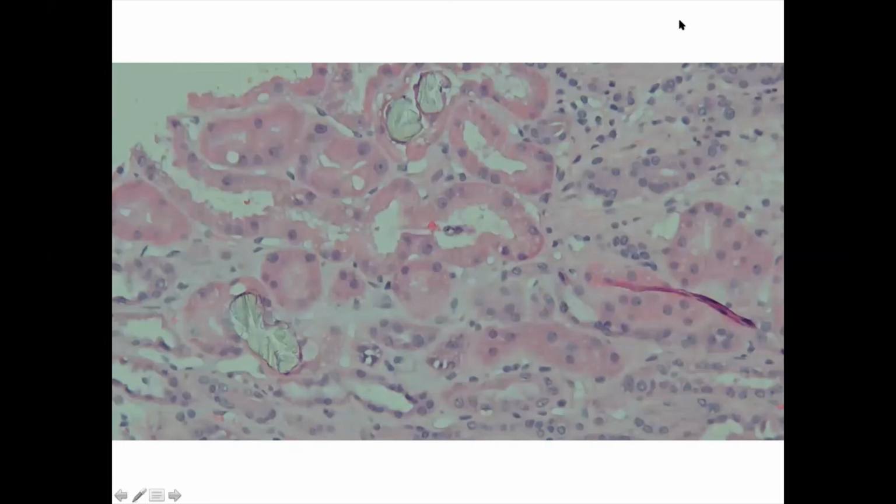Let's open the chat box. Okay, very nice. Hello. Okay, so what we have is oxalate crystals, precisely.